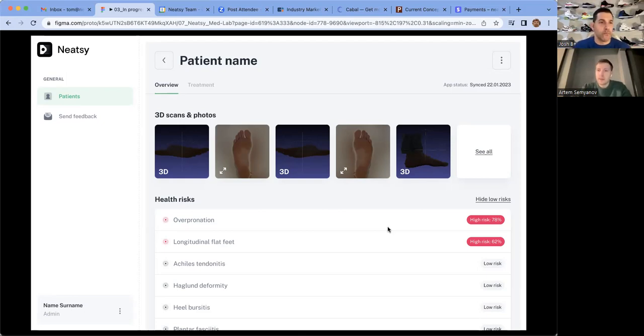So I always do something like a SWOT. I think the good parts: it's a really good, easy template here. It's easy on the eyes. I'm sure the scanner is probably idiot proof, where it makes the portion of the foot a different color, so when you take the picture, you can actually see you have good images and things like that.